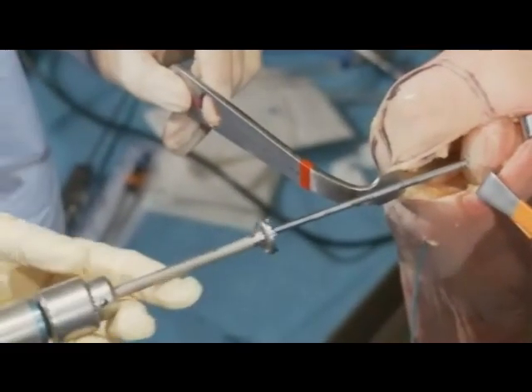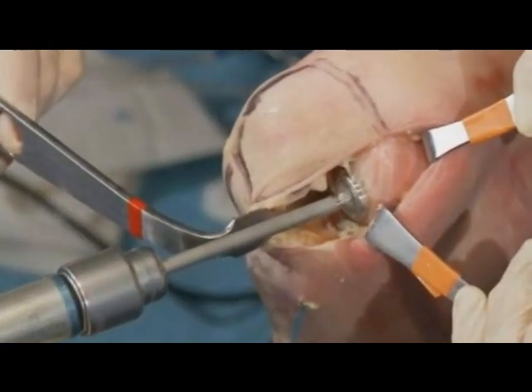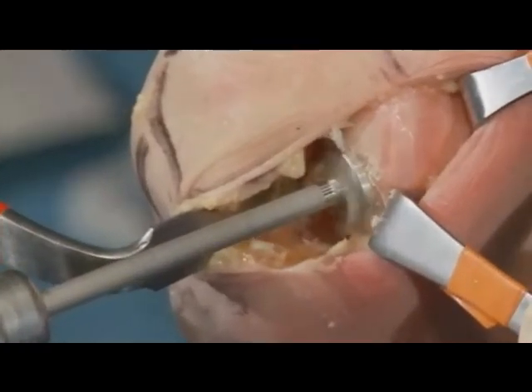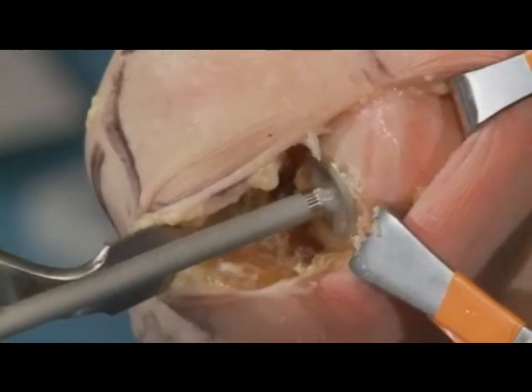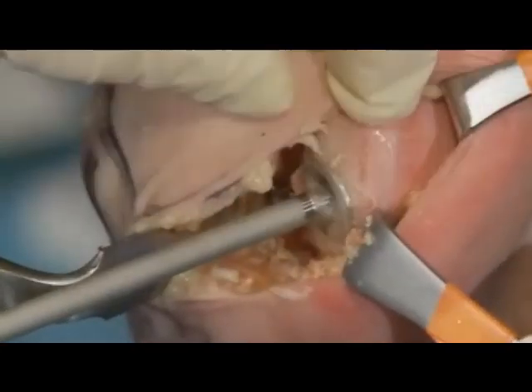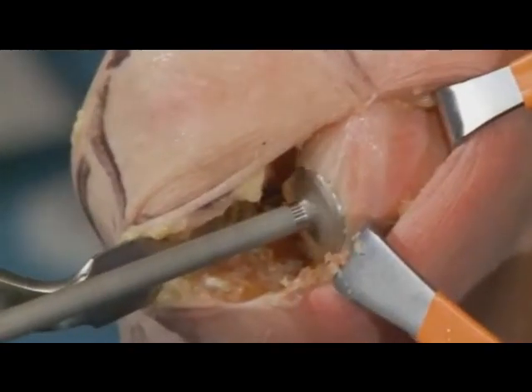Now, the beauty of this system is that it's calibrated so that you can see it cuts, and it will stop cutting as soon as it hits the screw below it. So that everything is calibrated. And what I like to do is take it, you can hear the pitch change, it won't go any further. We've cut it, and you can feel around it and say, yeah, that's the level that it wants to be at. That's where my new joint is going to be.